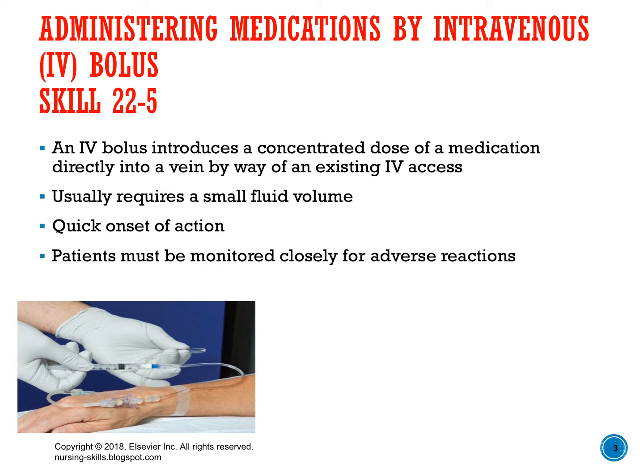One advantage of administering medications via bolus is that it requires a small volume of fluid, and this is key in a patient who's at risk for fluid volume excess. We don't want to give them more fluid than they can handle. Another advantage is that medications given this route have a very quick onset of action, which is what is needed if there is an emergency type situation, a cardiac arrest, if your patient's in pain and you need pain relief quickly.